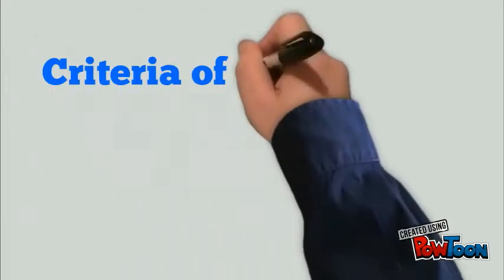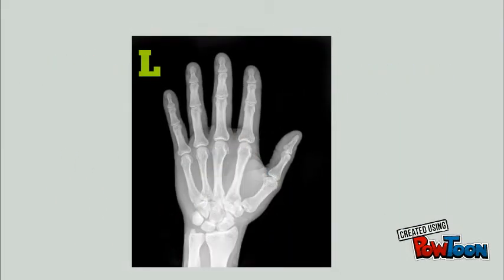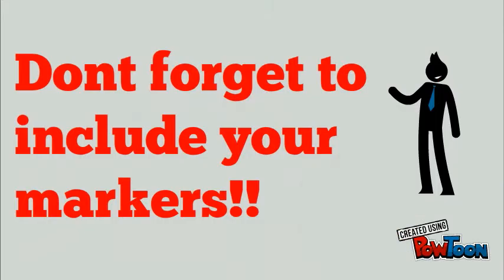On both projections of the hand X-ray, you must ensure you include all the anatomy of the image criteria, from the distal phalangeal tufts up to the distal third of the radius and ulna. Don't forget to include your markers.